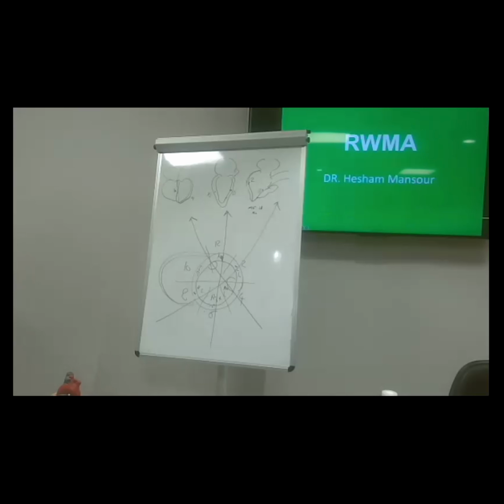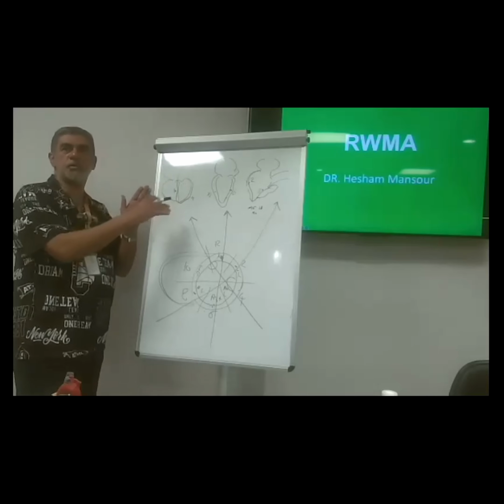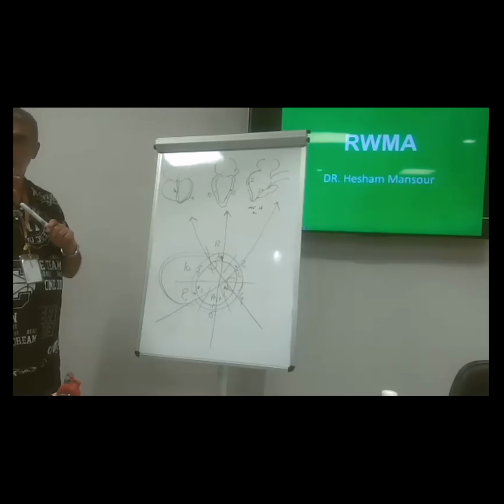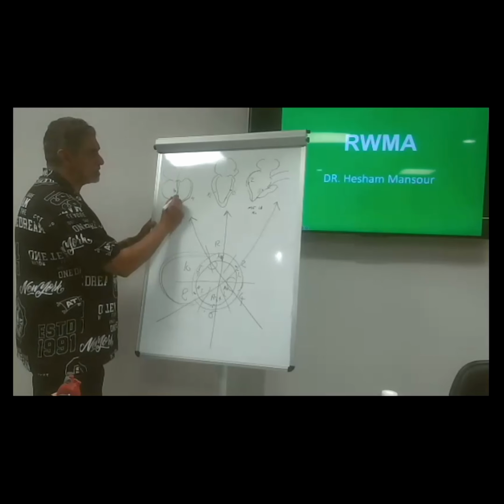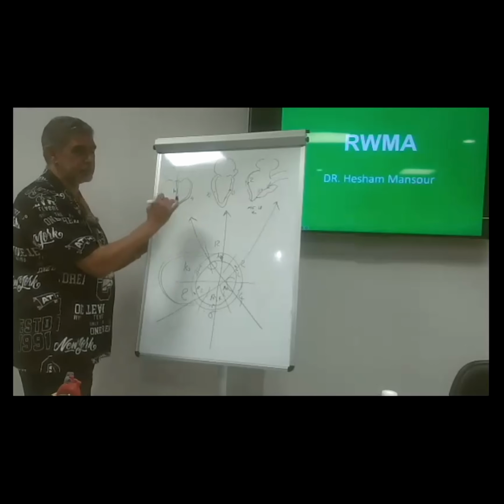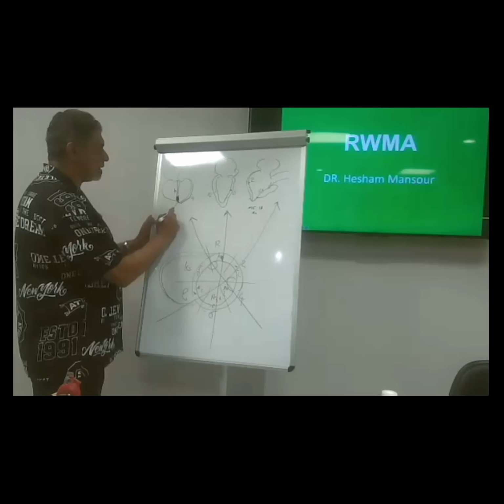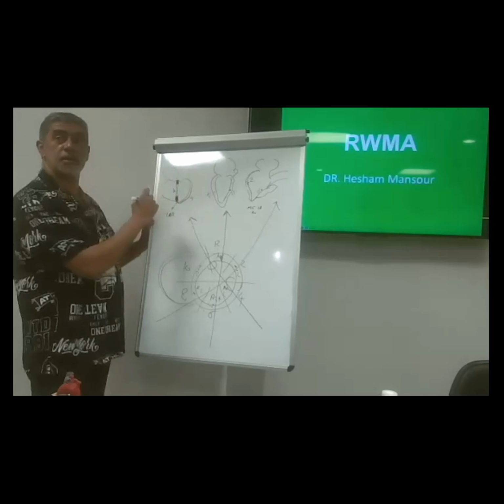I didn't take it into consideration because usually we have a mixed coronary supply in this view. To be fair, this area in the base is LAD. This area, sorry, in the apex, I added, is LAD, and this area is RCA.